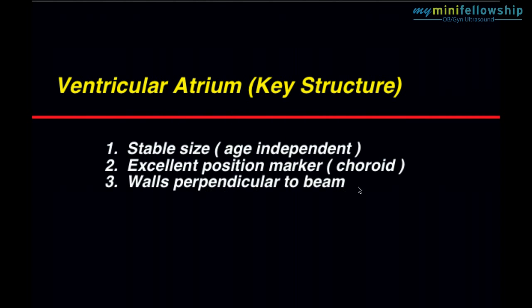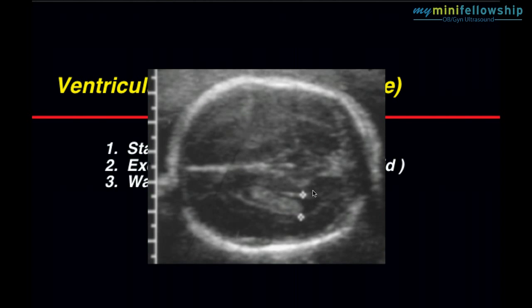The walls of the ventricular atrium are reasonably perpendicular to the direction of beam travel, which means that they will specularly reflect, which means they'll be easier for us to see. Indeed, you can see that the medial wall is a better specular reflector than the lateral wall, and that is also highly fortunate.